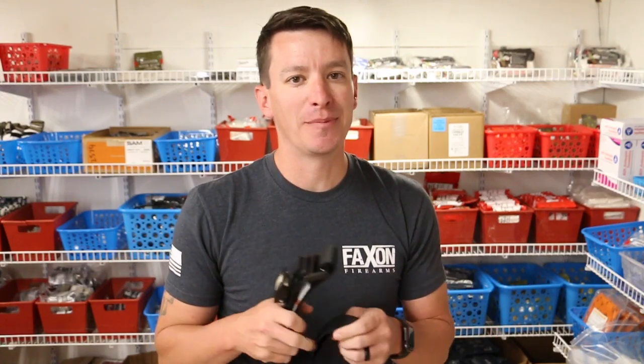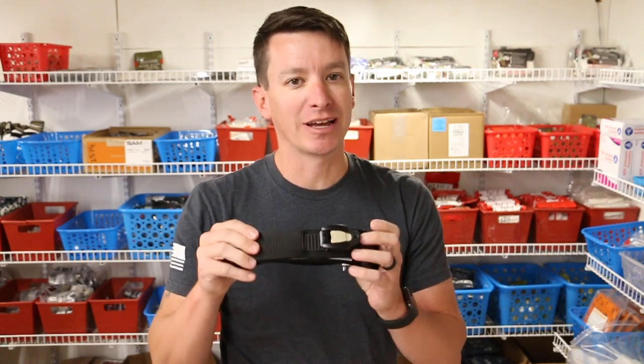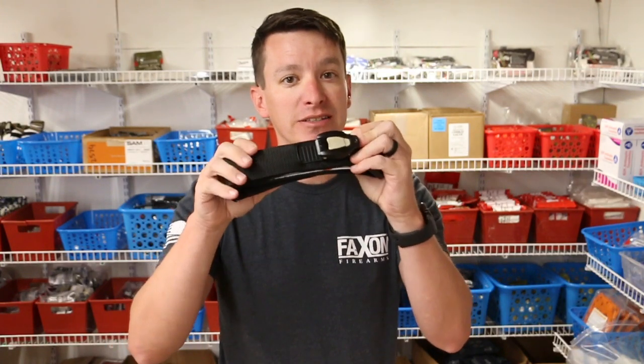Hey, welcome to another video from Skinny Medic. In this video, I'm going to talk about an easy way to EDC a tourniquet and wear a belt at the same time.